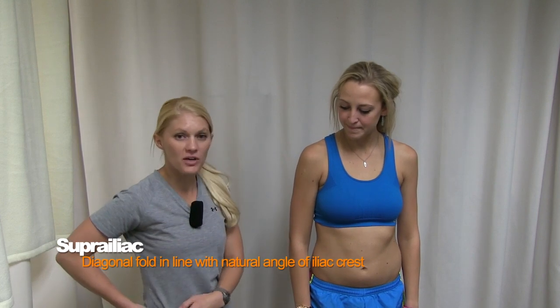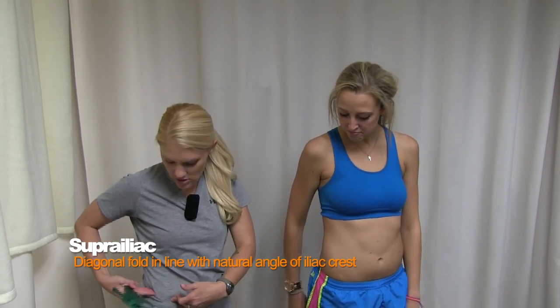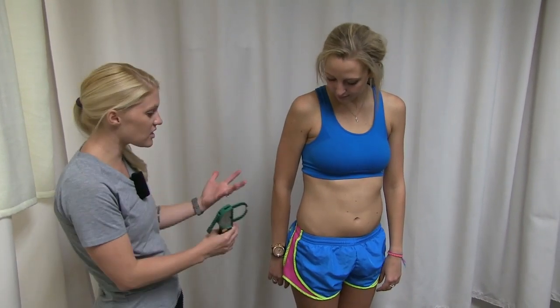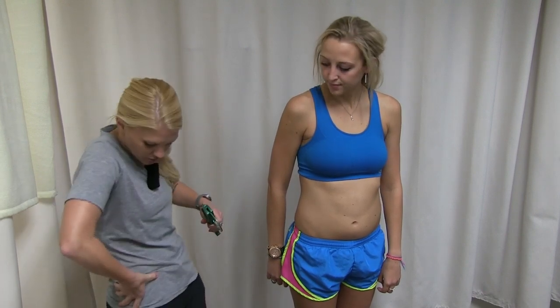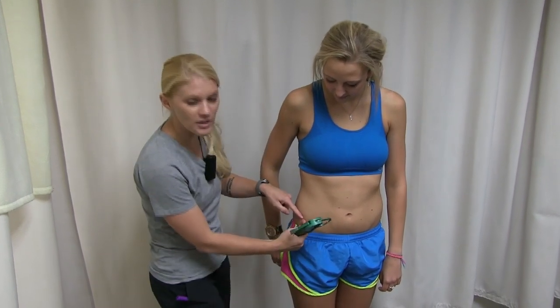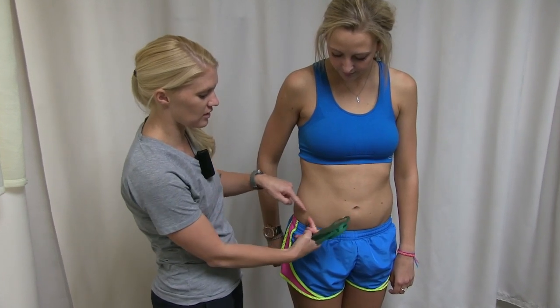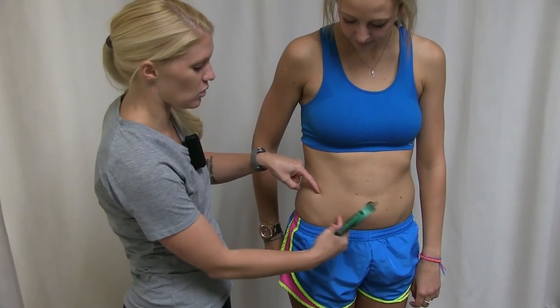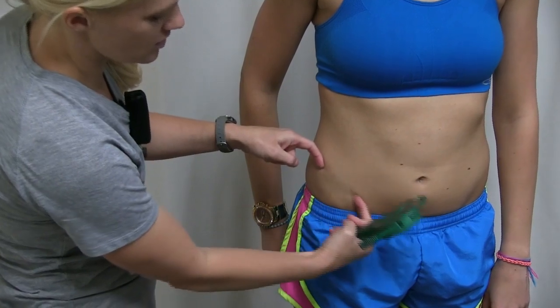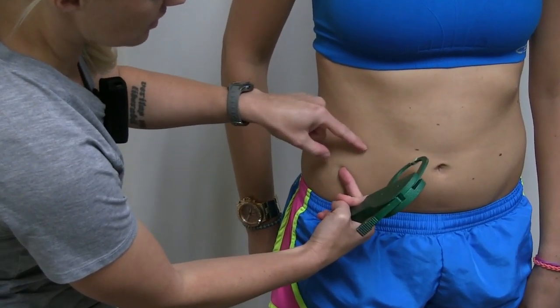For the super iliac measurement, locate the iliac crest on the hip — 'super' means above it. Have your subject help find their own hip bone, since some people have high hips that are hard to locate visually. Here's the top of the iliac crest. Measure one inch above it with a diagonal fold, keeping it on the front of the body — not the back — along the front iliac crest diagonal, about an inch above.